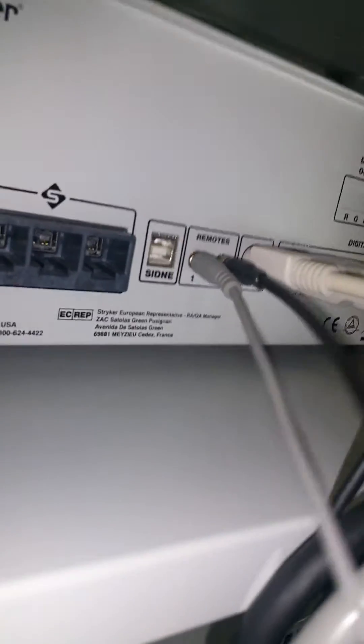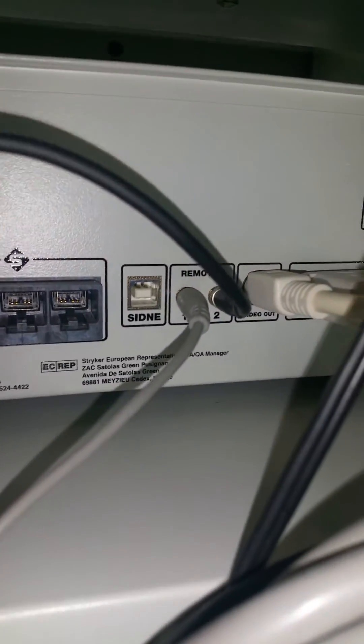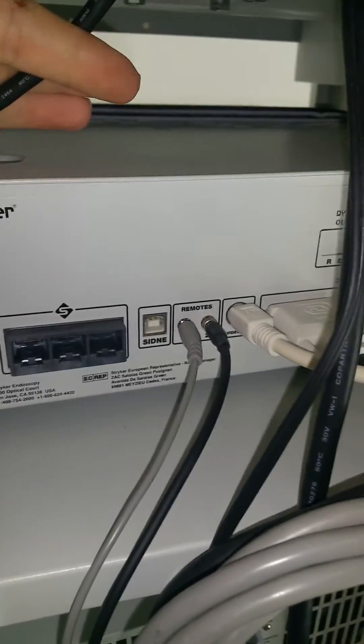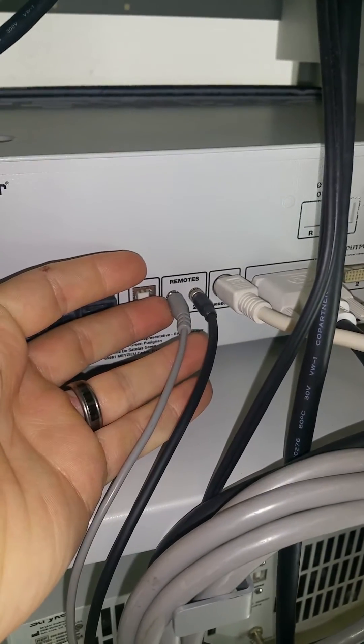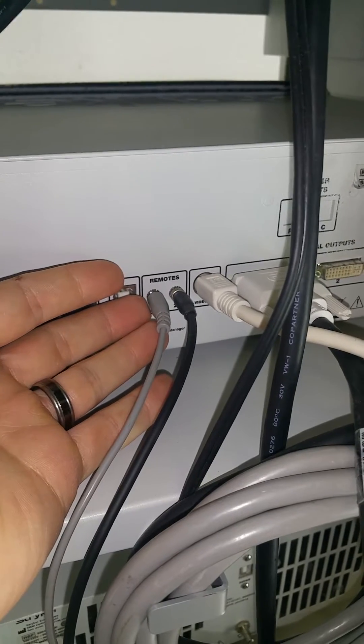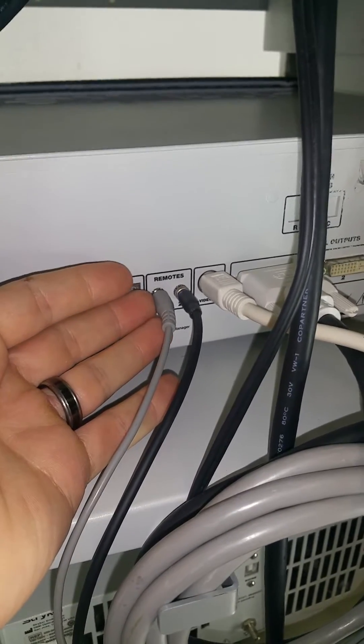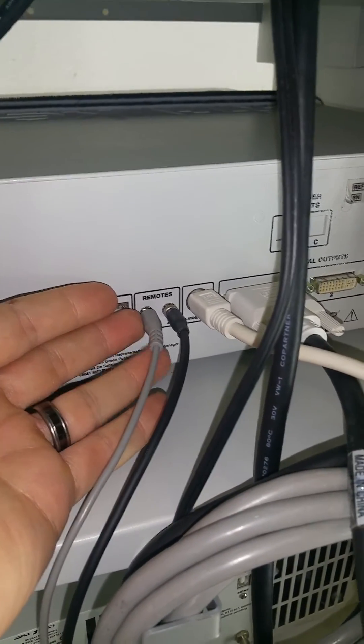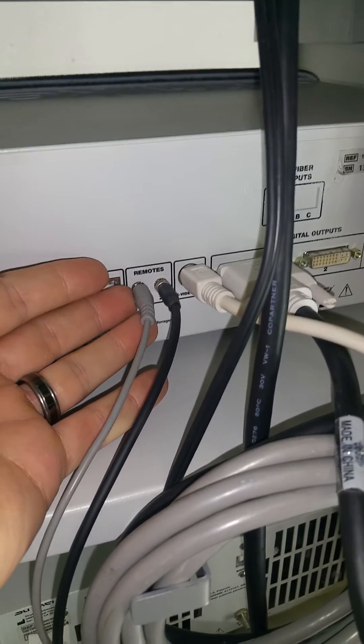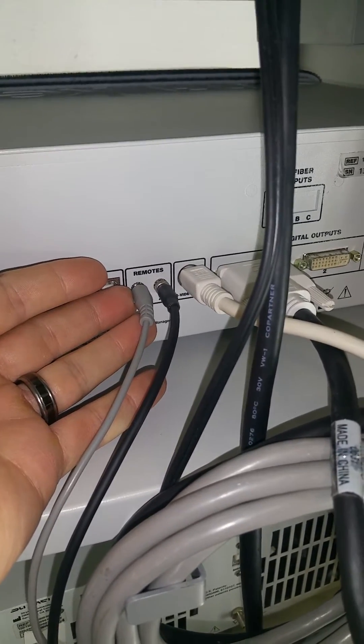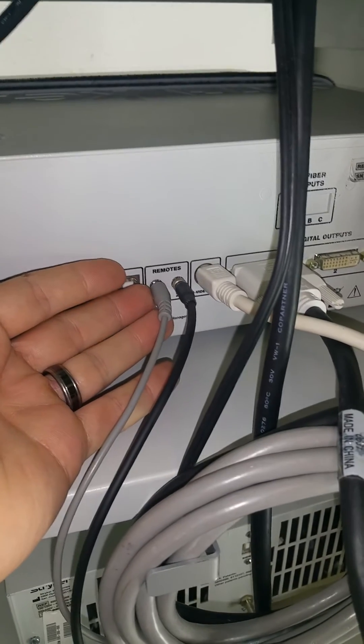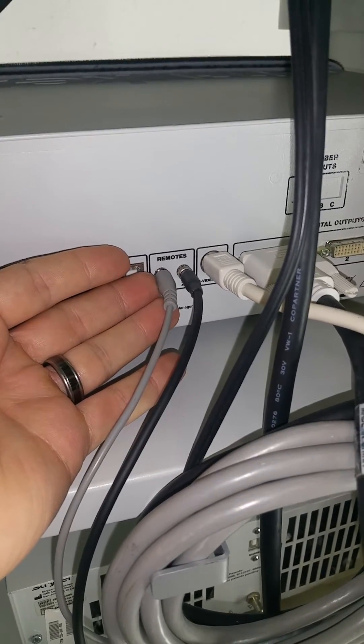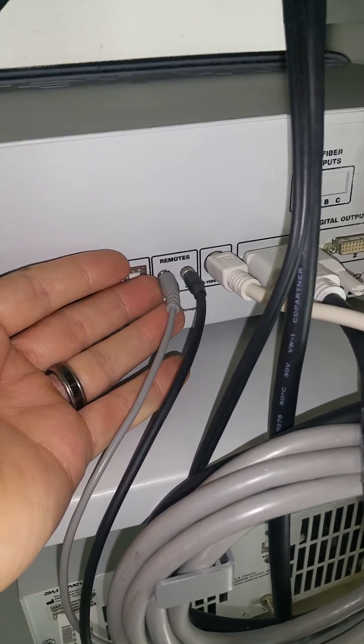They are, as you can see there, labeled remote one and remote two. They're very important because they control the camera functions. So when you press photo or record on the camera head itself, this is what tells the computer or the SDC to take a photo or to record.